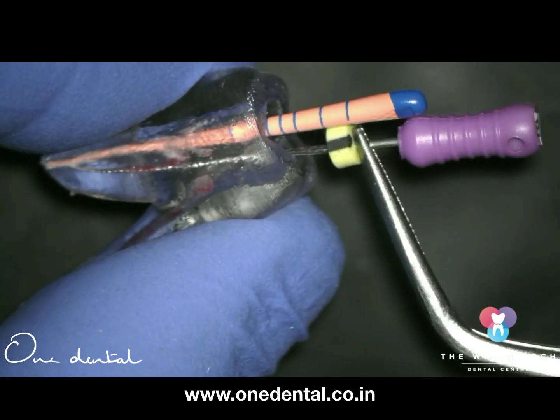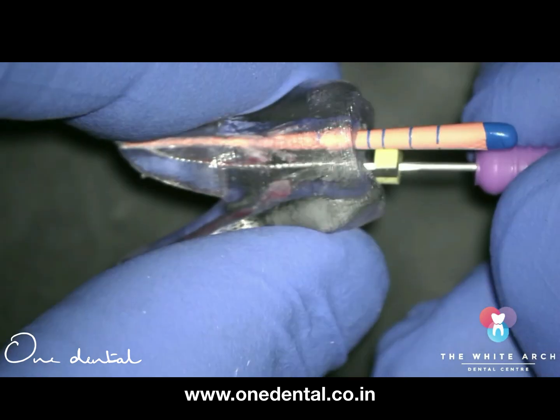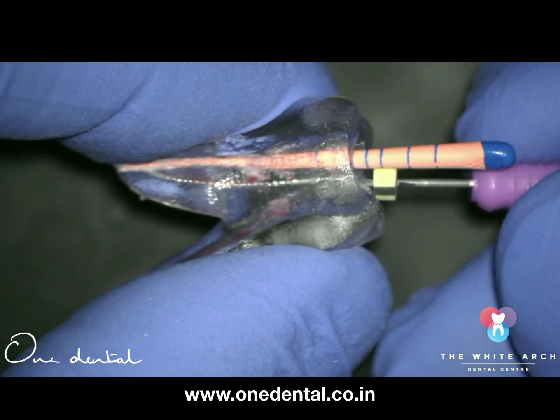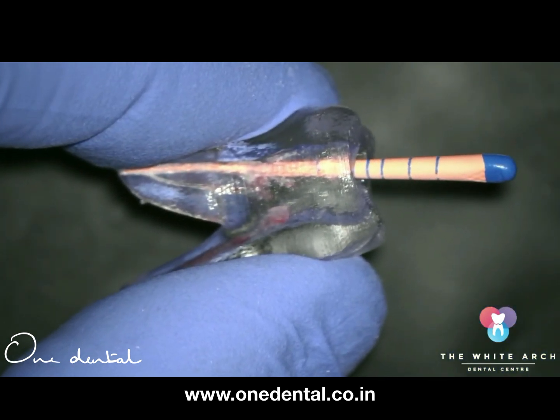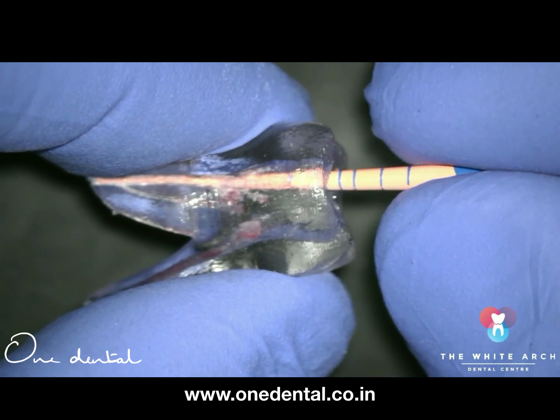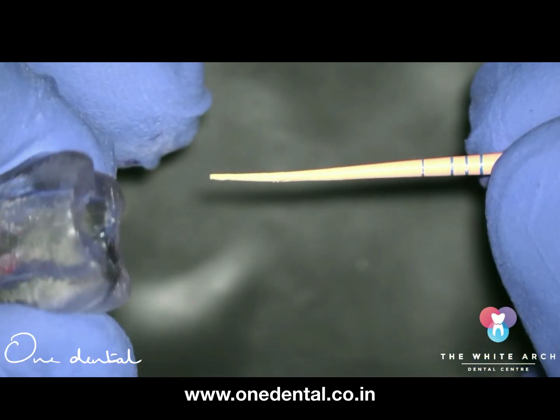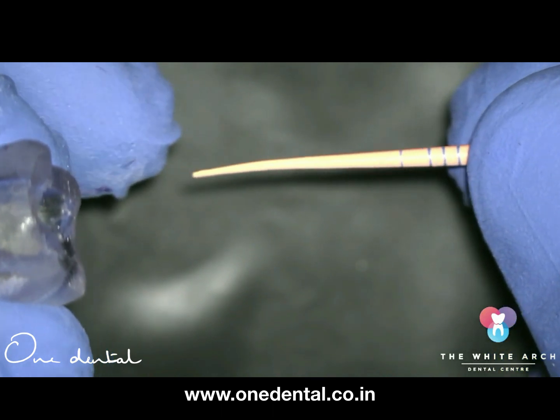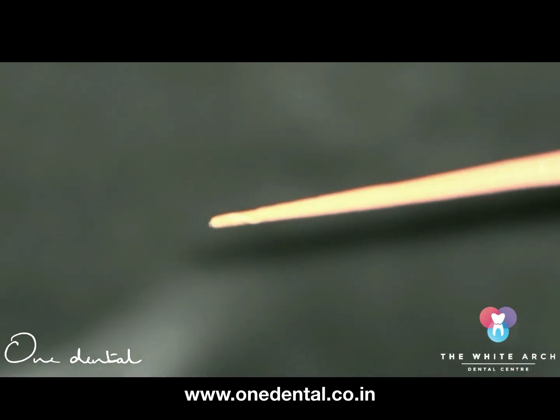More importantly, look for the indentations. When the number 10 file tries to pass from the second canal to the main canal, it will make some bite marks — indentations. Remove the master cone and check for those indentations. If those marks are closer to the tip of the master cone, it simply means the root canal you're going to work on in the second canal is going to be that much more difficult.